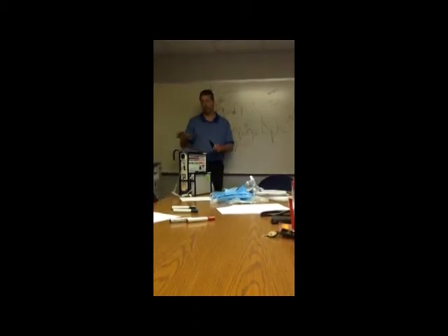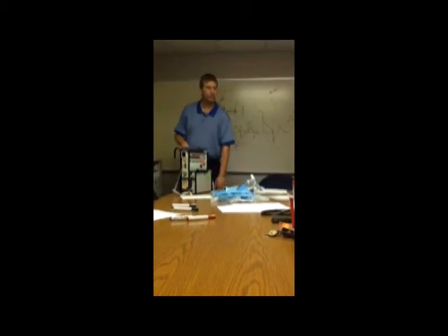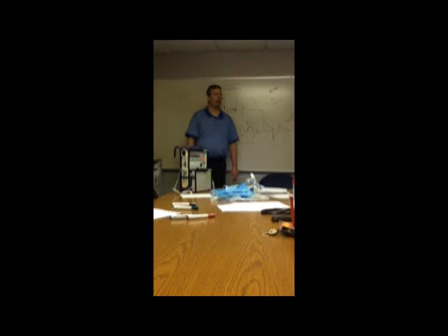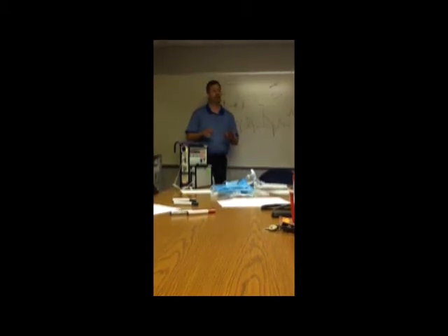It comes in from the path of least resistance, all the big holes in the mask. Those bags mean nothing on non-rebreathers anymore. I'm going off on a tangent, but it's bothering me. Sometimes you can dial it down a little bit unless they're collapsing that bag. You'll never see them collapse the bag now.